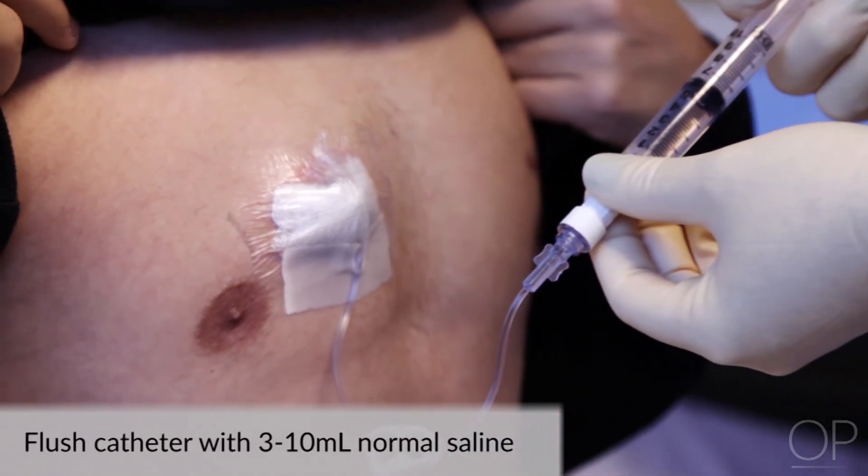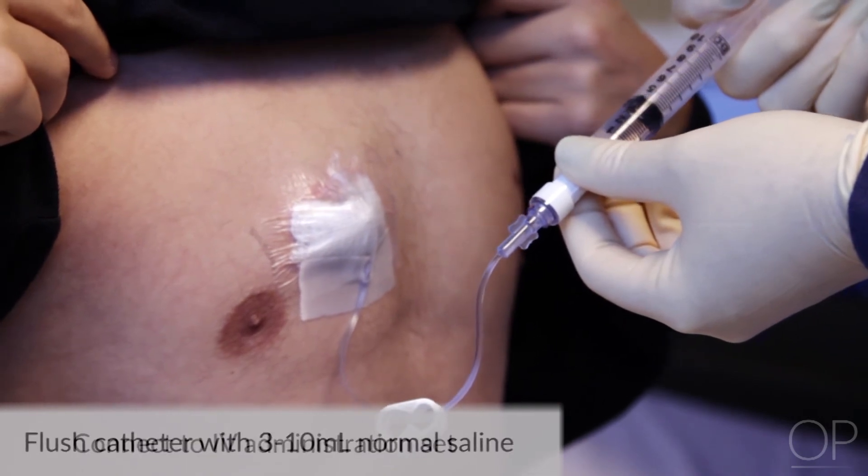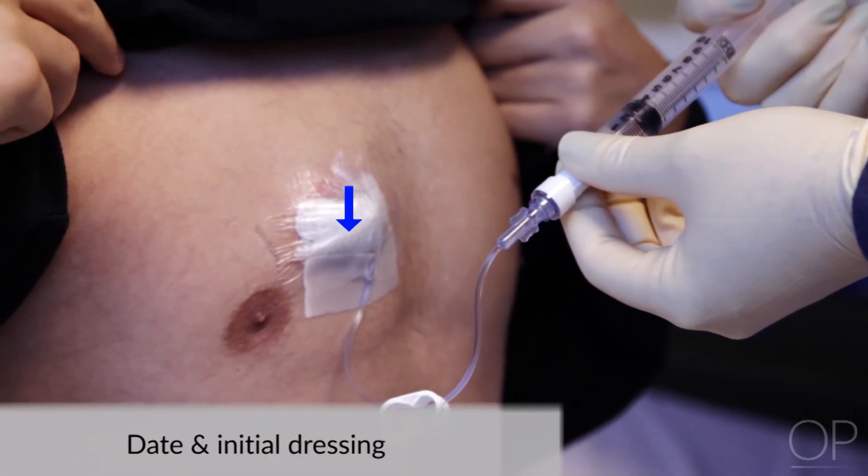Unclamp the extension tubing and gently flush with 3 to 10 mLs of normal saline and connect to your administration set. Date and initial your dressing.